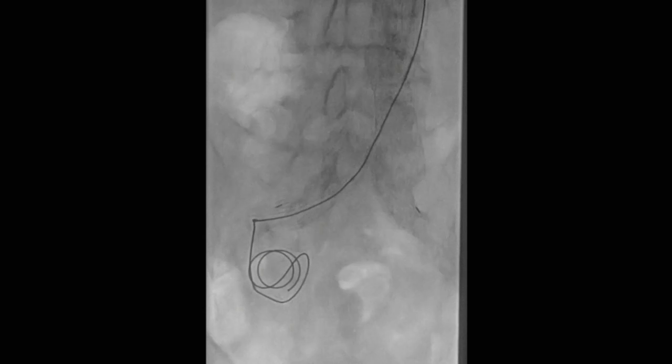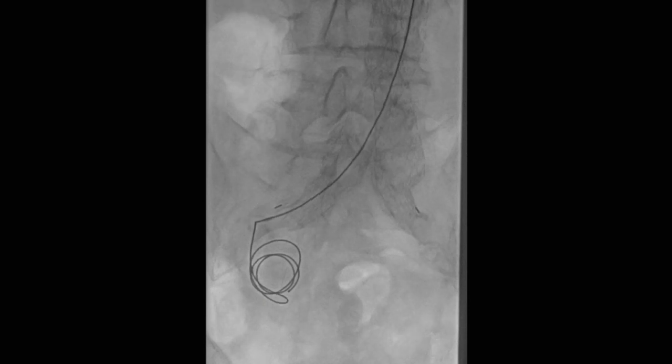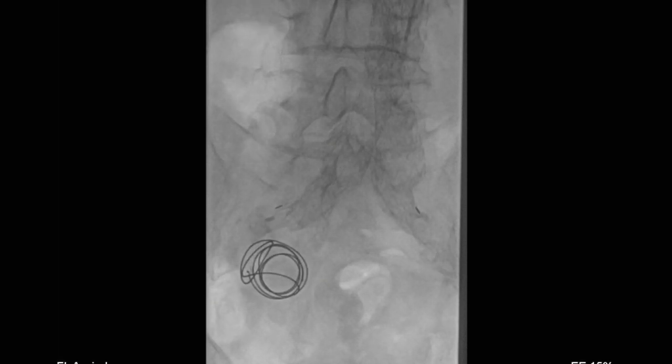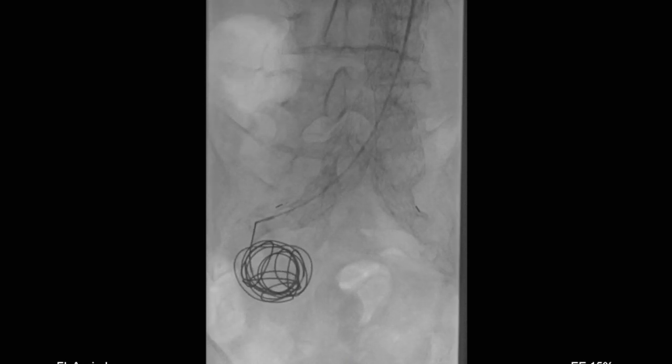These are Interlock coils from Boston Scientific — they are detachable, so you can place them and then make a decision before you fully deploy them whether you like the position or not. These were 40cm long, 20mm diameter coils. The concept is that you start with big coils and then start packing the interior with smaller diameter coils.